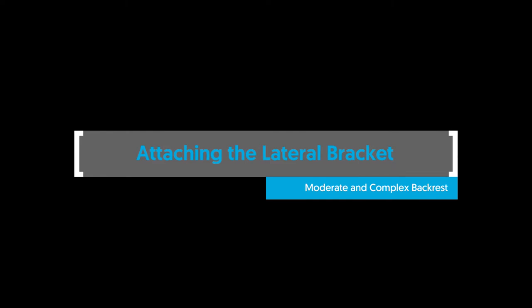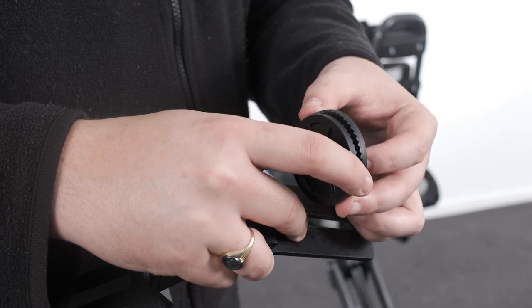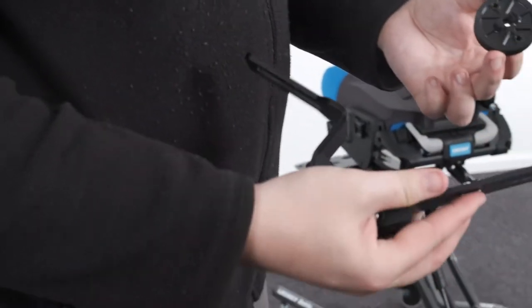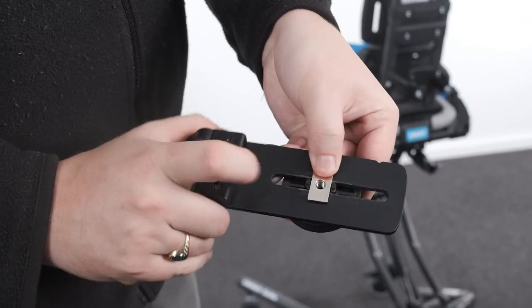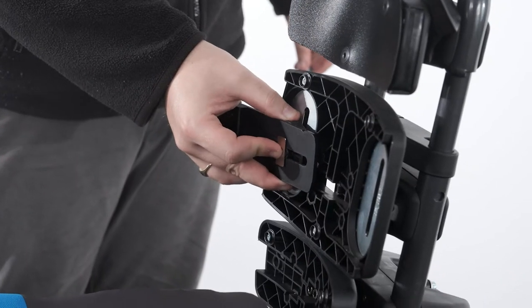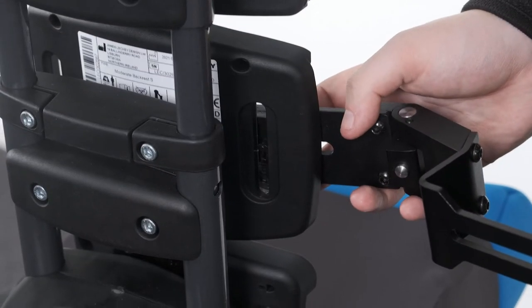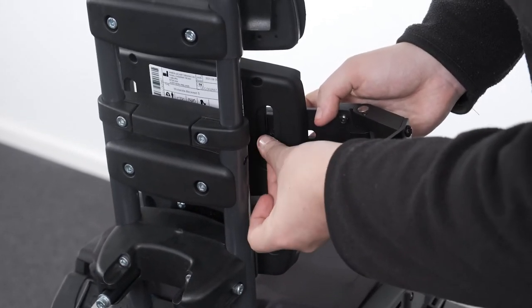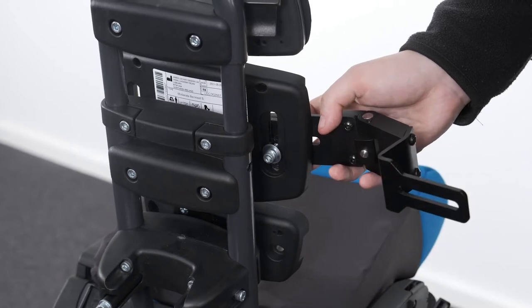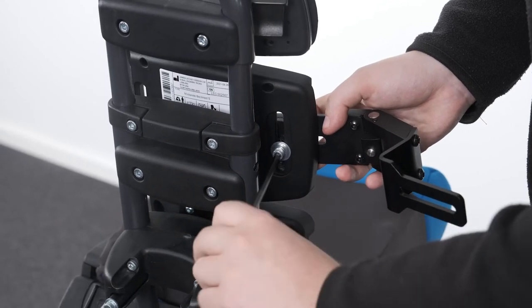Attaching the lateral bracket — moderate and complex backrest. To attach the lateral bracket to the moderate and complex backrest, place the T-nut into the slot in the lateral bracket. Mesh the two sides of the radial clamps together and locate the protrusion of the radial clamp into the slot in the opposite side of the lateral bracket. Place the radial clamps into the recess at the front of the thoracic moulding, ensuring the protrusion of the radial clamp drops into the vertical slot. Place the split washer then the plane washer onto the bolt and pass it through the vertical slot at the back of the thoracic moulding, engaging the threads of the T-nut. Secure in place with the Allen key.